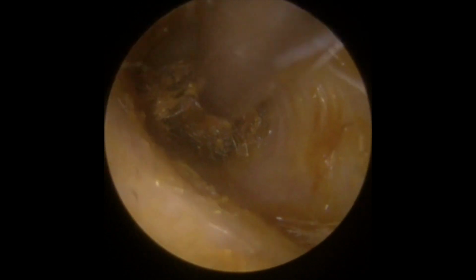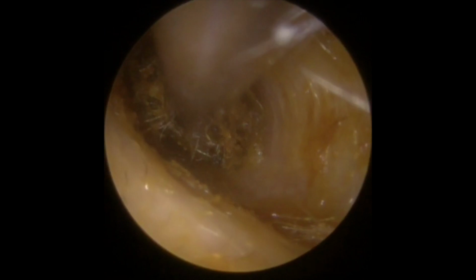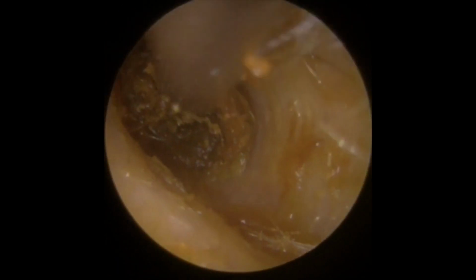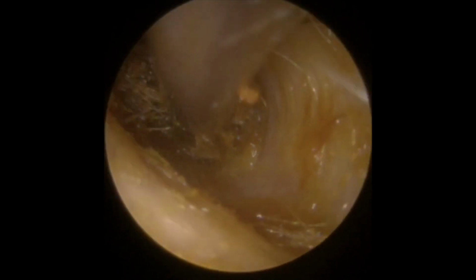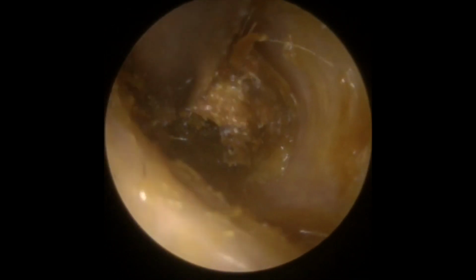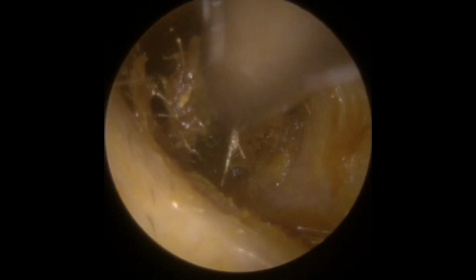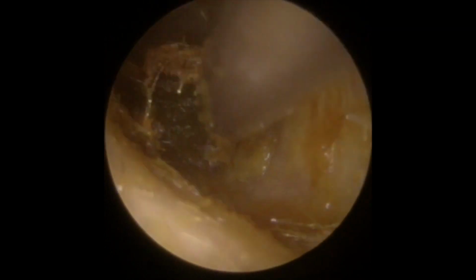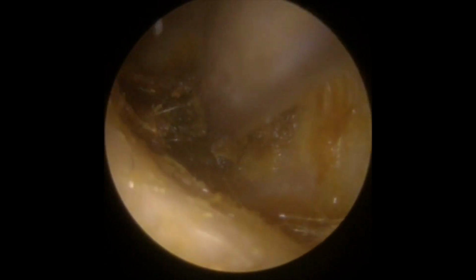There we are, just working on the sides, lifting from the bottom. You can see it's quite firmly wedged deep in that canal. A little piece just broke away, so we're just going to go and get the next section. There we go, just starting to see the top end moving a little bit. You can see how deep this piece is. If we can unstick this right side, we will probably be able to get this out in one piece.